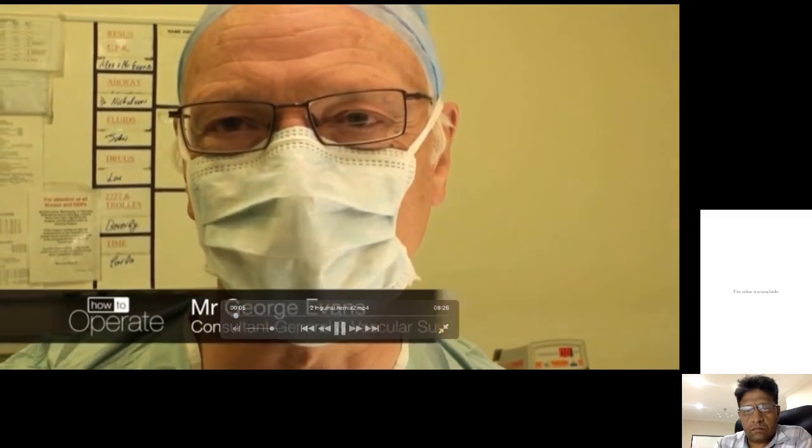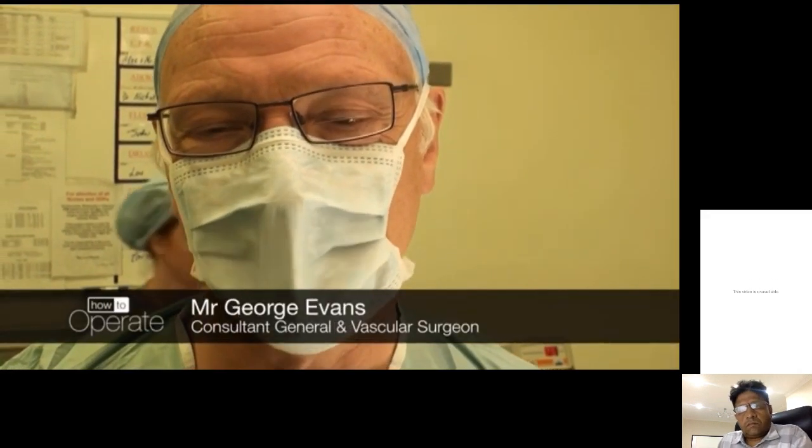This is a 75-year-old lady with a left inguinal hernia. She's been getting symptoms of discomfort from this and a lump. She's previously had the right side done. Inguinal hernias in women are less of a problem than men because they don't have the spermatic cord. We're going to start the operation now. We're planning to put mesh in.